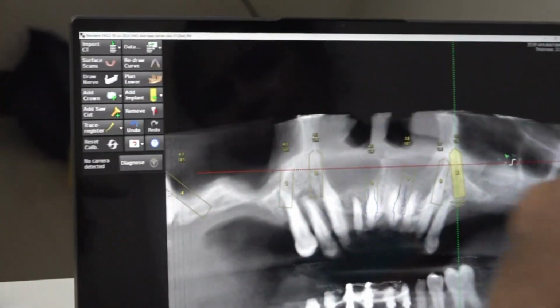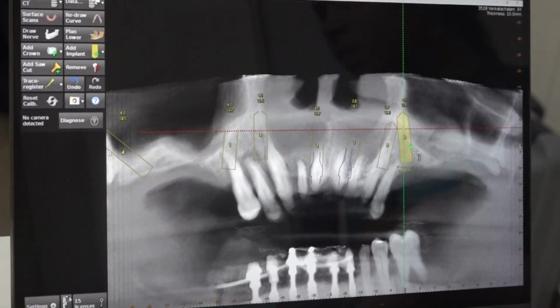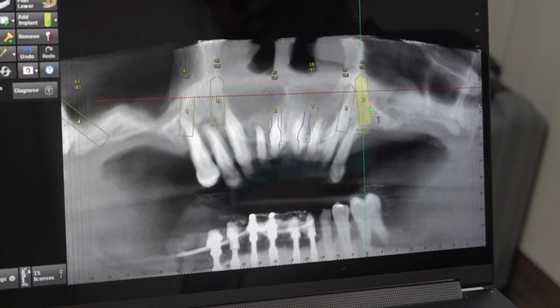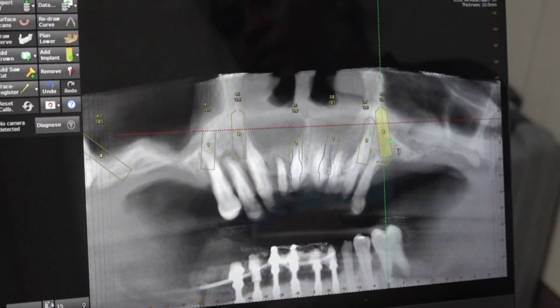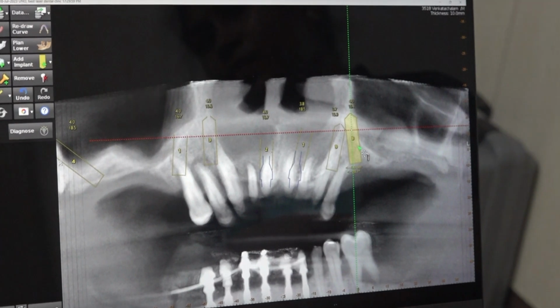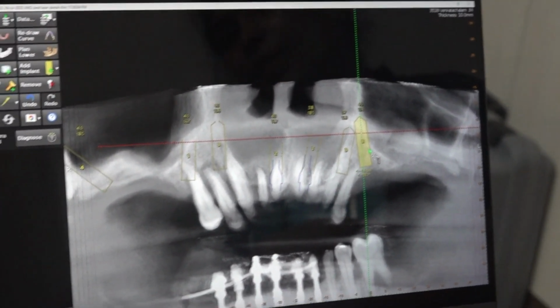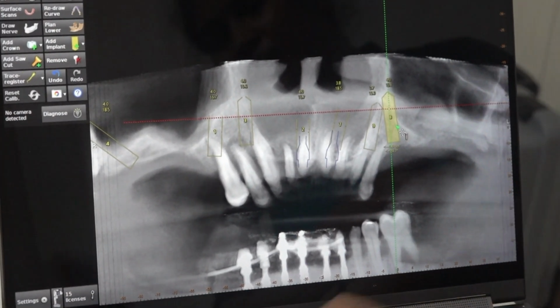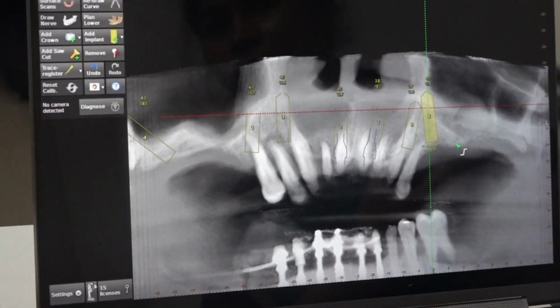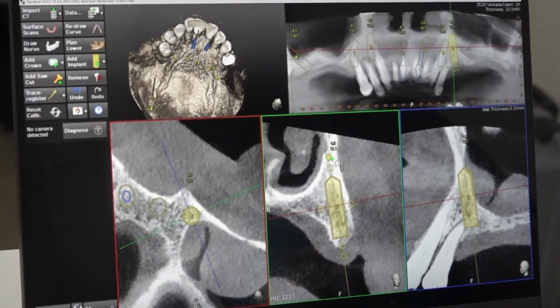Even though in panoramic view they are looking very close to each other, it is not showing red. Why? Because the 2-5 implant is buccally tilted. We are starting palatally and drilling towards the canine, that mesomaxillary area, buccally. But the canine implant we are going almost straight, but towards the palatal aspect. This implant is coming buccally, this implant is going palatally. That is why, even though they are looking closer in the panoramic, you should never believe the panoramic view. You can take it just as a guideline.